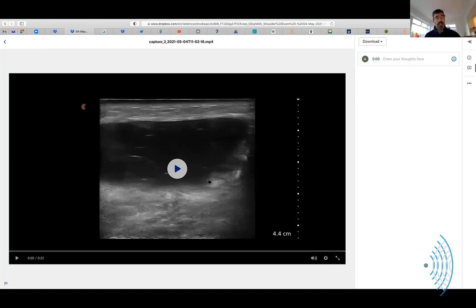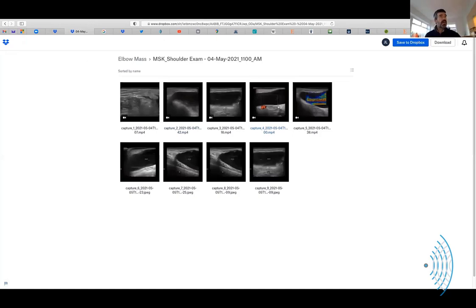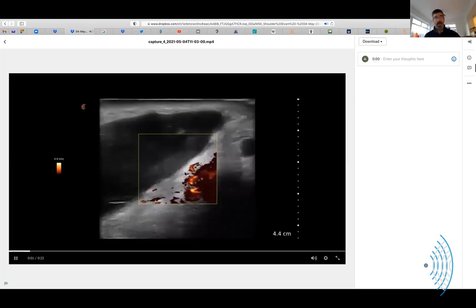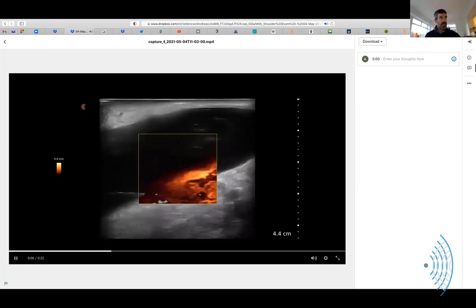Anything dark, the bright lipomas, people can be a bit lazy about, but dark lesions, you're going to sleep very badly if you do that. If you don't hold the pressure off, you will get bitten, not by a lesion that looks like this necessarily, but by smaller things where you'll be just plain wrong, and it will have blood flow in it. So I do completely understand you saying, stop moving the probe and lighten up your pressure.